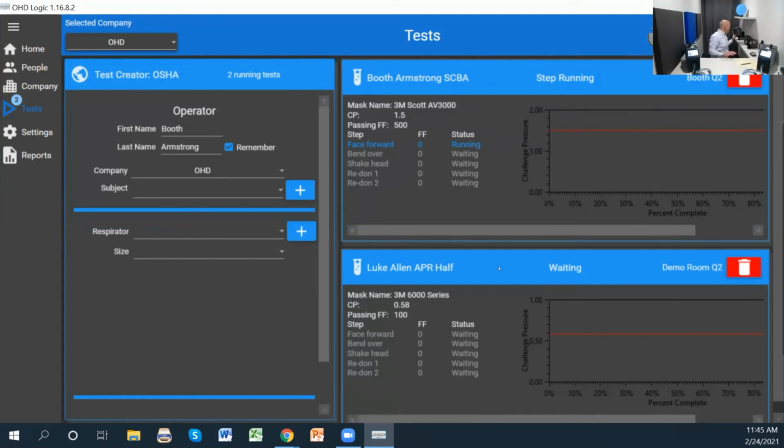So, all right, now let me jump in this respirator and do a test. While I'm doing a test, Dr. Lynch will provide you with some basic commentary. I'll mute my mic, and Dr. Lynch can provide you with some basic commentary as I go through the testing process.